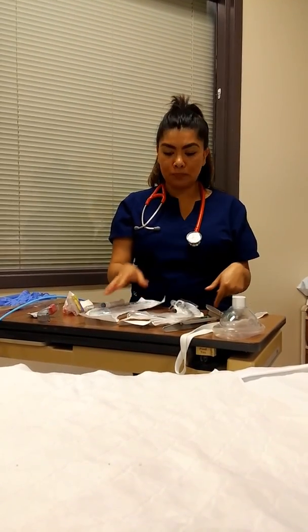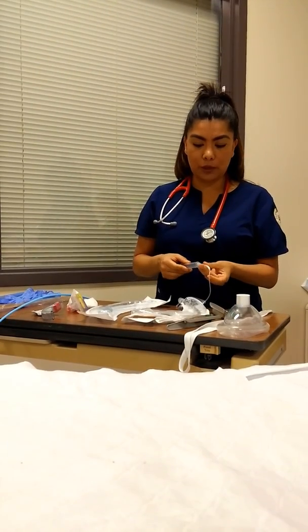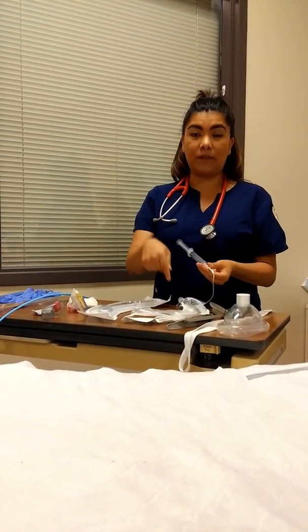We want our tubes, so our endotracheal tubes. We want to have two sizes: one of them the same size that the patient needs, and one a size smaller. We want to make sure that we have a stylet to help us guide the endotracheal tube. We want a syringe, which is going to help inflate and deflate the cuff on the endotracheal tube, so we want to make sure that it properly works.